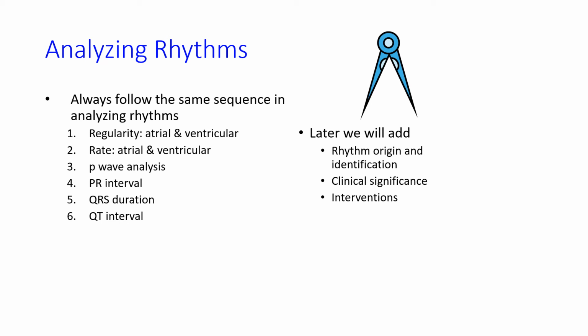Later on, when we talk about the different rhythms, you're going to talk about where the rhythm originated, identification, the clinical significance, and the interventions that you would do. And your job, whether you're a monitor tech or a nurse, differs. The monitor tech will usually have different responsibilities, such as notifying the nurse, or the nurse may have to interpret the rhythm and then notify the physician if there's something that's significant.